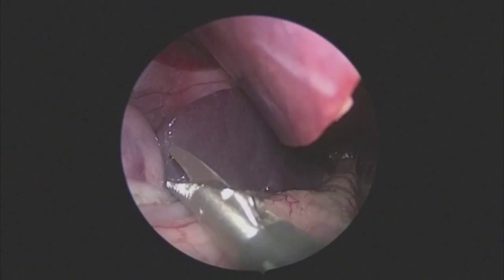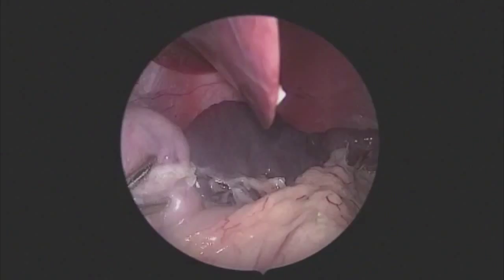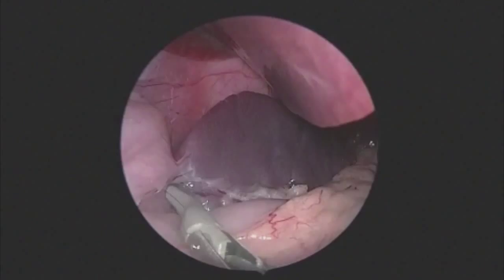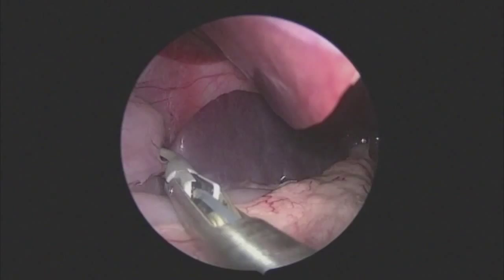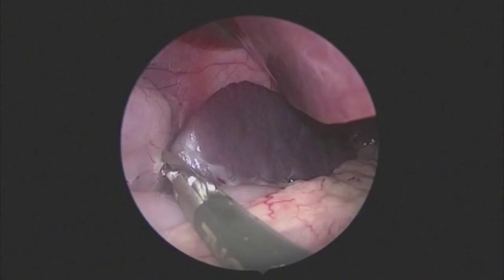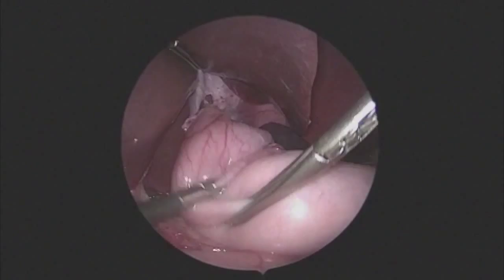We limit the amount of short gastrics we take, really taking only the upper few, in order to free the higher aspect of the greater curvature from the spleen to allow for a tension-free wrap. Minor attachments between the stomach and the spleen can be sealed and divided or sealed and torn. It is important to mobilize until you expose the left crus of the diaphragm, to ensure that the wrap is tension-free.